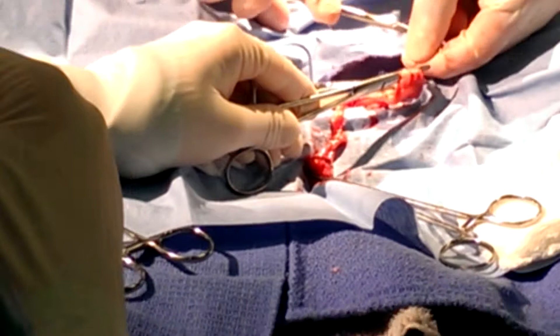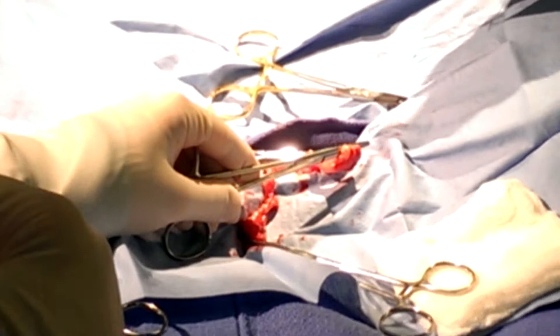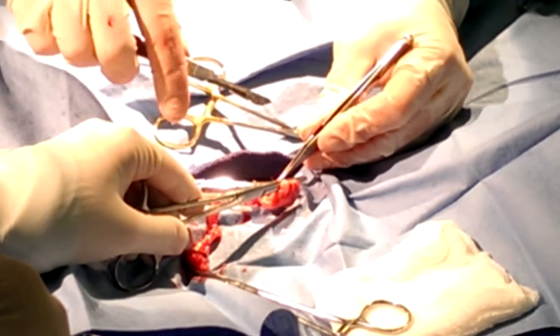Let's try to do a two-millimeter cut. Good job — you just don't want to go too close to the knot for obvious reasons; you don't want the knot to come apart. Just enough that no more than necessary is left. I should be able to finish this whole surgery with just this one strand at this point. That suture stays with the dog — it doesn't come with us.